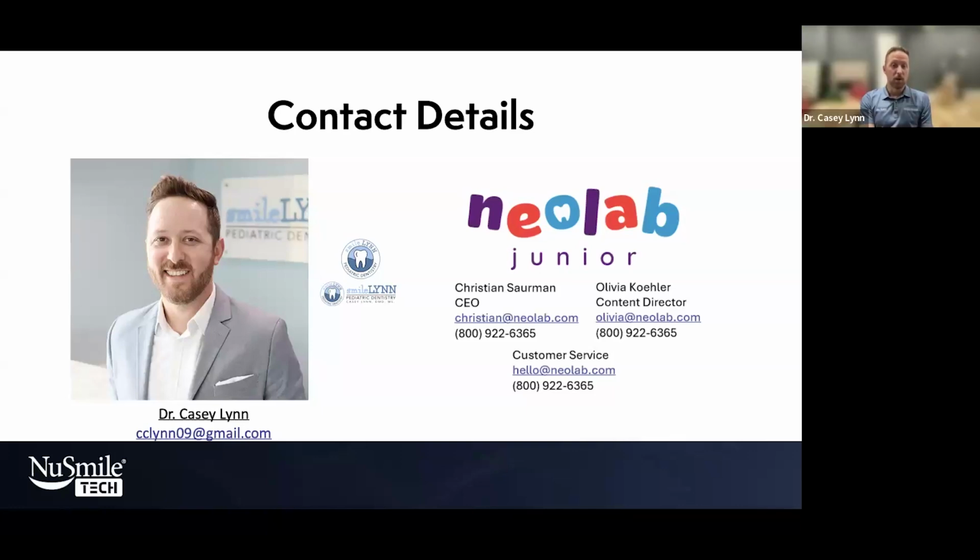So yeah, it will show caries. If you wanted to use this as a parent education tool or a patient education tool, you can utilize your scan for that. Obviously, you're not going to use it for caries detection. You're going to use it more for visualization for patient or parent education. I wouldn't take a scan and say that's for sure caries, because we're taught to do more than that to diagnose. But if you look back through some of the slides and the scans, like, okay, that's an abscess, broken down tooth A, you're going to see it there. And it picks up a lot.